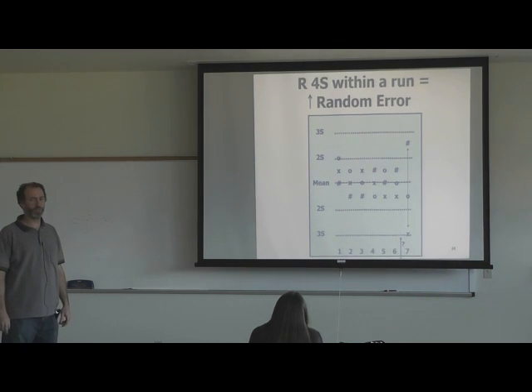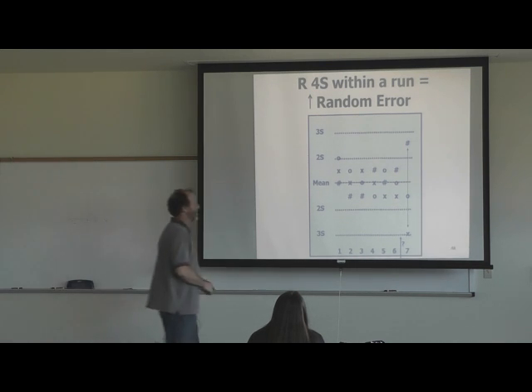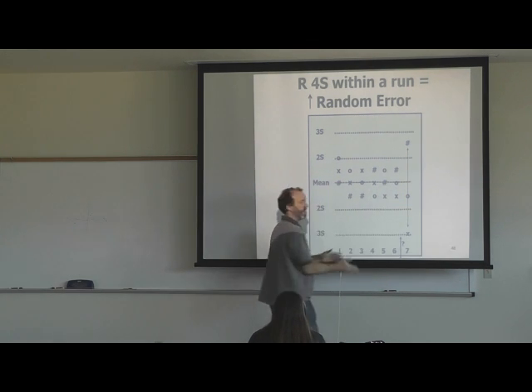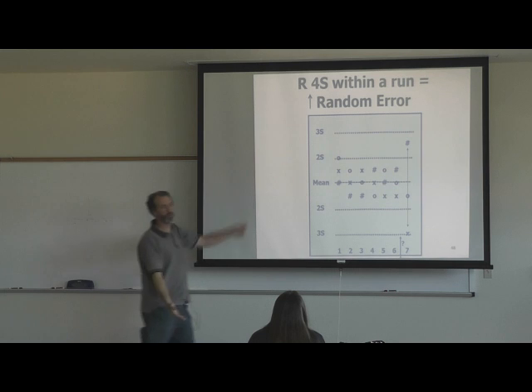Do you get these pictures now, Shafina? I get them, but I'm practicing to see if I actually really get them. Okay. So again, this is an R4S because you're greater than 4 standard deviations between those 2 controls.